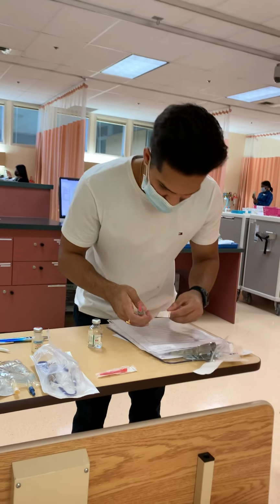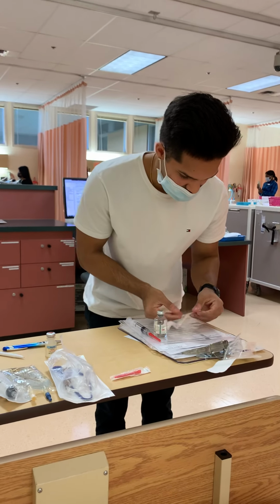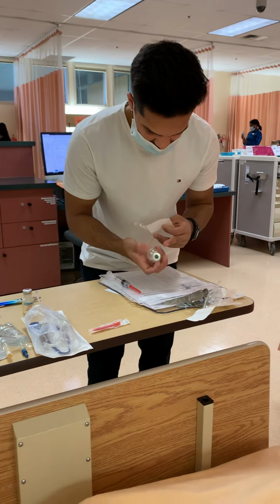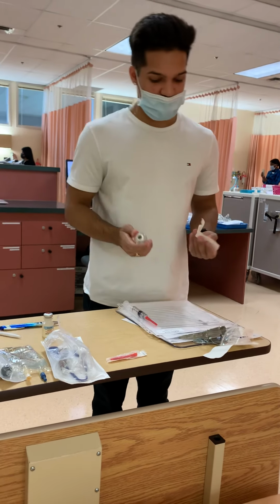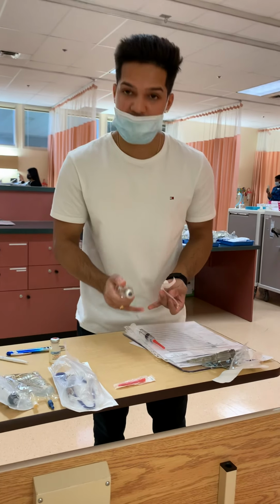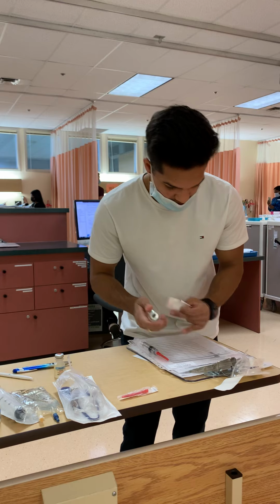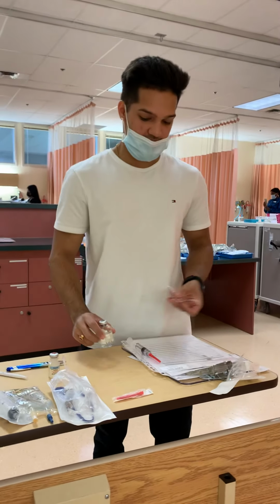Okay, so the medication we're giving is cloxacillin, and this is cloxacillin, and the dose we're giving is 1 gram. And since the final concentration is 250 milligrams per mL, therefore I have 4 mLs of medication in my syringe. And the route is IV, and this is IV infusion only. The time frequency of medication is every 6 hours, not given, signed off for on October 20th at 0600, so I will be giving it.